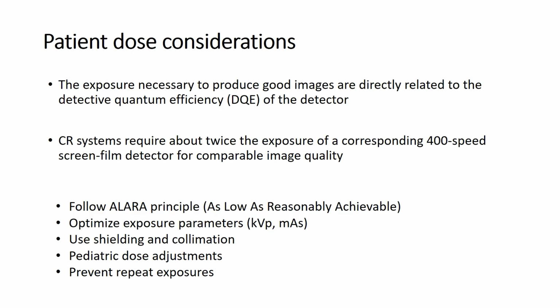So, let us discuss some other important points related to the digital radiography system, like patient dose consideration. Patient dose consideration means the exposure necessary to produce a good image, which is directly related to the detective quantum efficiency of the detectors.